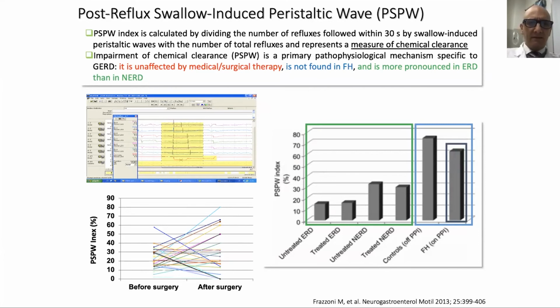Moreover, Marzio Frazzoni described that probably the PSPW index is not affected by the treatment.